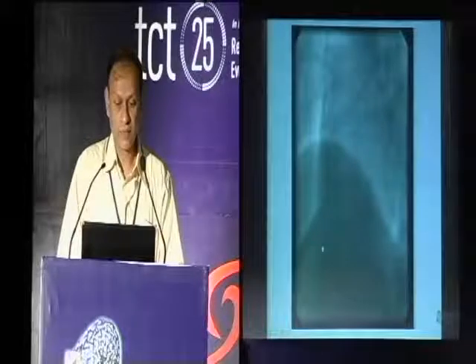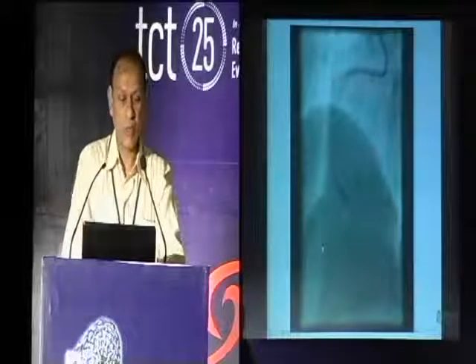So we just tried to push in the balloon and the guiding catheter got disengaged. And this is the amplification technique of the Judkins right, wherein we pushed in the catheter and do a little counterclockwise rotation. You amplify the Judkins right and engage it deeply. We could push the balloon down, we could push the stent down, stent the vessel, and did a little bit of more deep throating of the guiding catheter.